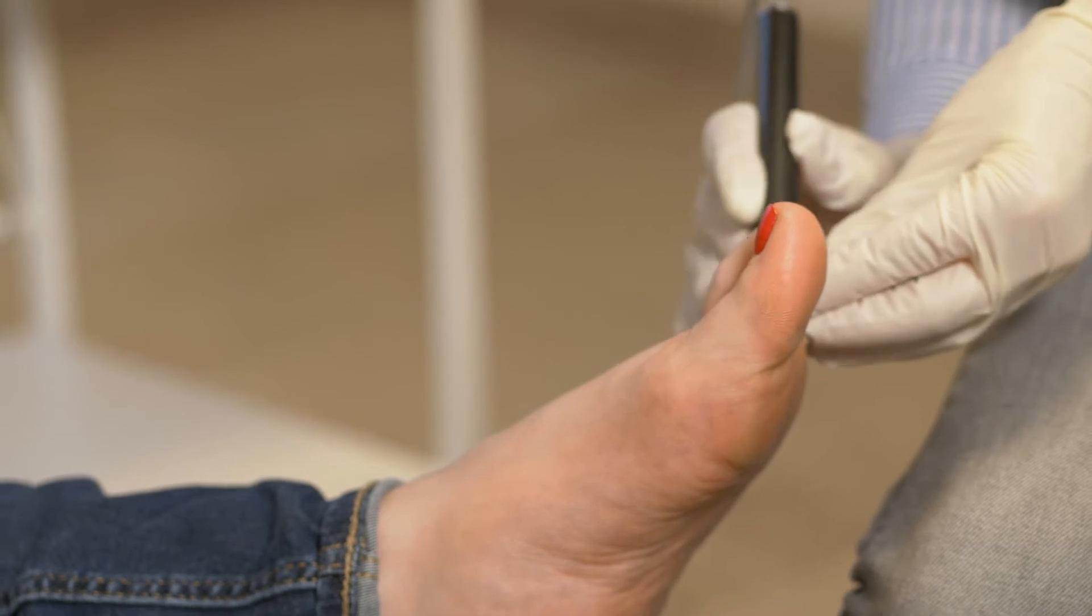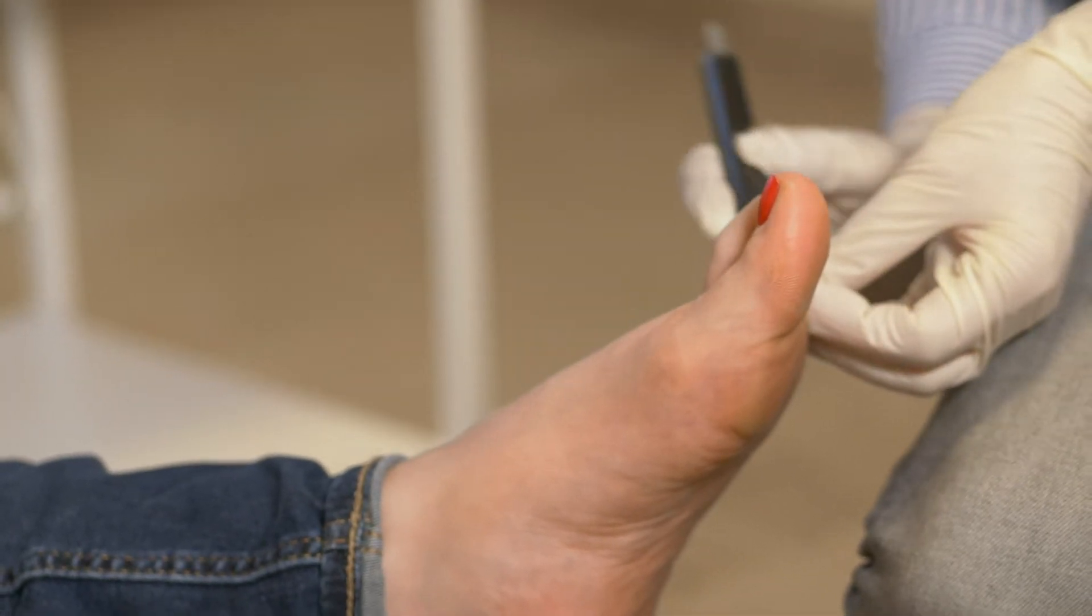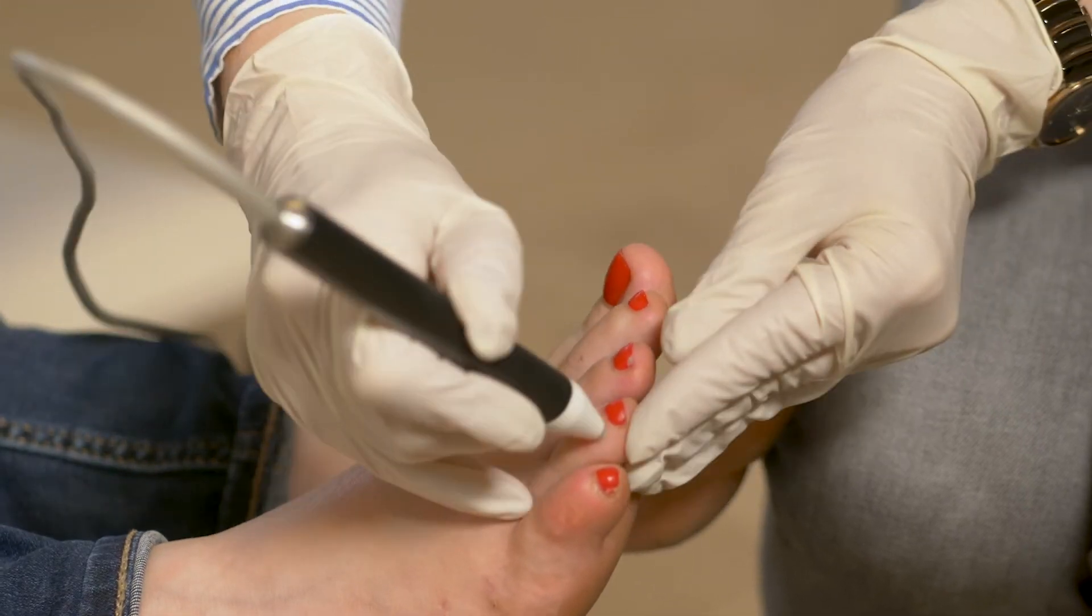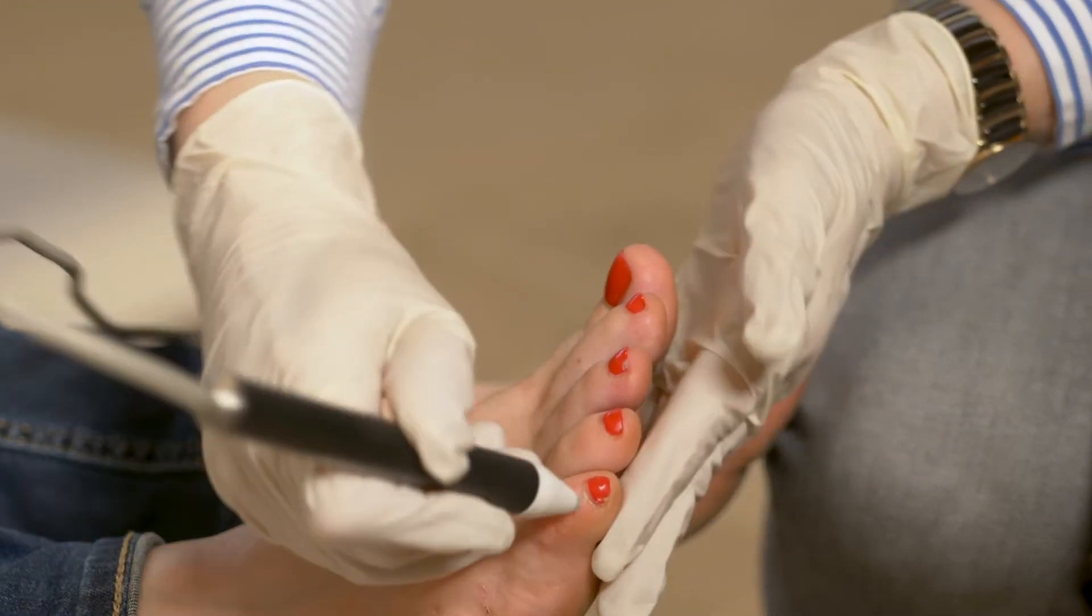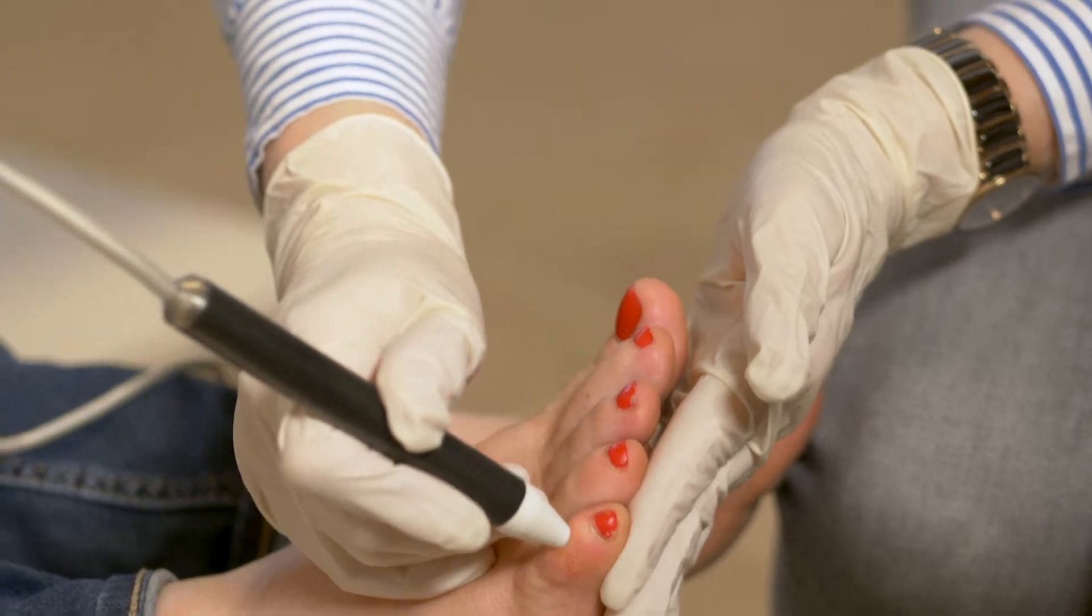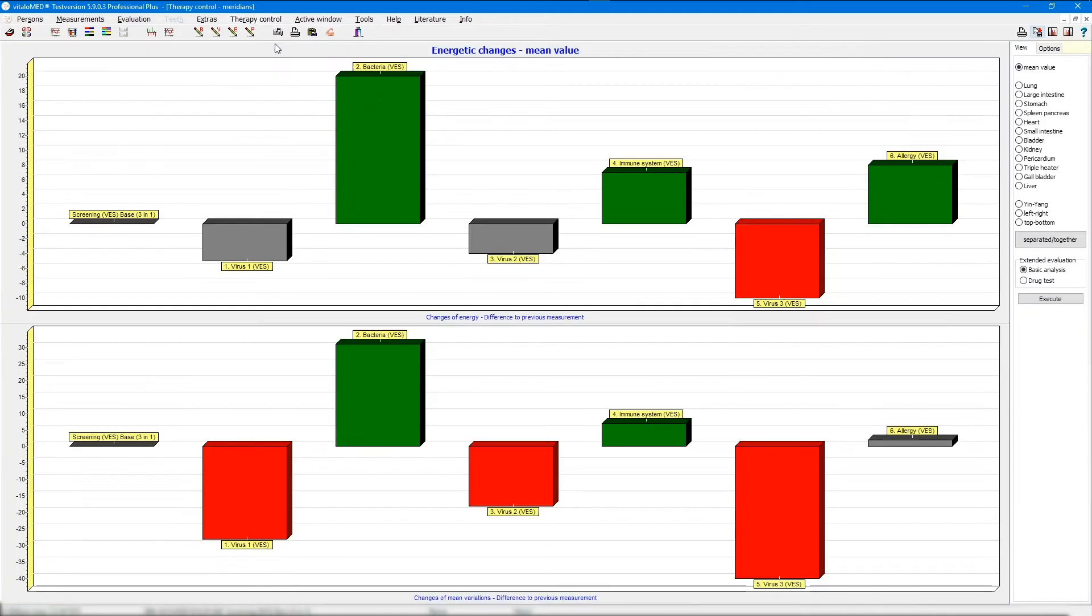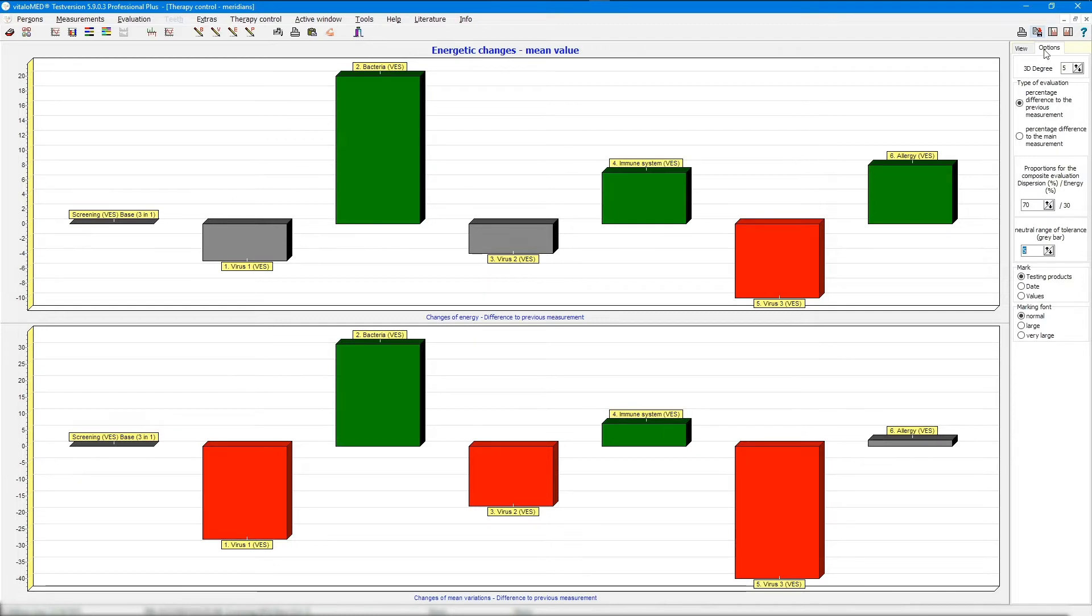For visualizing the results, click the button Therapy Control in the upper toolbar and select Therapy Control Meridian. For a better summary, click Options on the right-hand side and change proportions from 70% to 30% to 99% to 1%. Then click View and press the button separated together. This gives you an easy to interpret graphic.